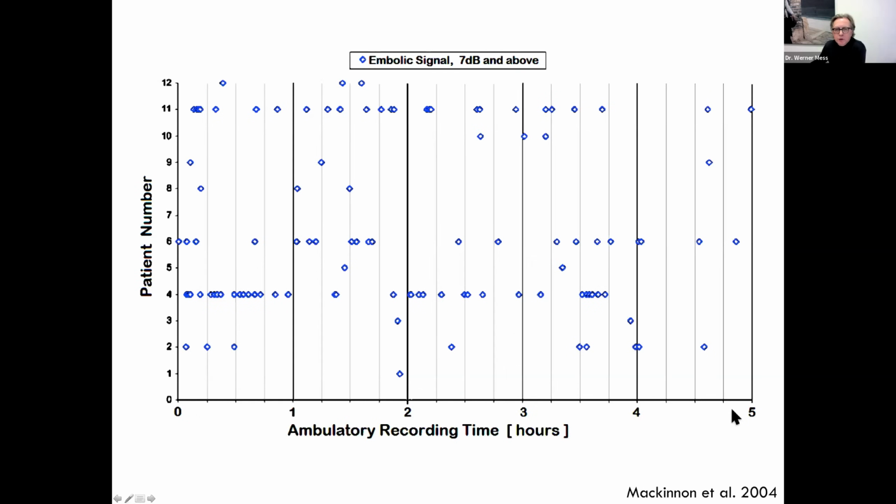And here you can, for example, see patient 4. You see that there are a lot of emboli in the first hour, considerably less here, but the 5th hour is completely negative. So I said before, usually a monitoring session would last for 1 hour. So if you would do the monitoring session here, that would be a false negative result. So that is a little bit of a problem.